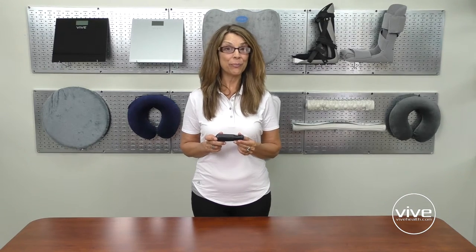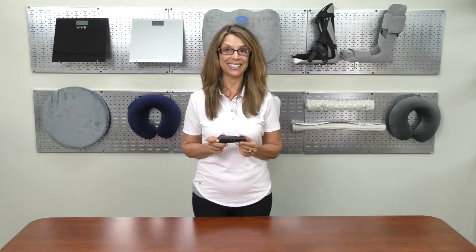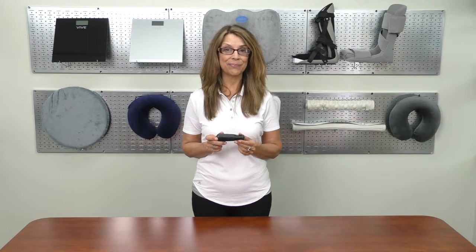Hi, I'm Karen from vivehealth.com. The Vive Button Hook is an essential tool for anyone suffering from limited dexterity. The non-slip, extra-wide handle is extremely easy to grasp and has been designed to facilitate an effortless grip.